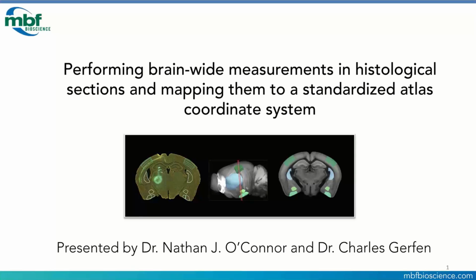Today I'm honored to have renowned neuroanatomist Dr. Chip Gerfen with me. He's just getting connected now, but we're going to be presenting a workflow we've developed for mapping neuroanatomical structures that have been labeled in histological sections to a whole brain standardized coordinate system. So here, that's going to be the Allen CCF and its corresponding atlas, that you'll see, that lets us compare measures across animals, groups, experiments, and even laboratories.